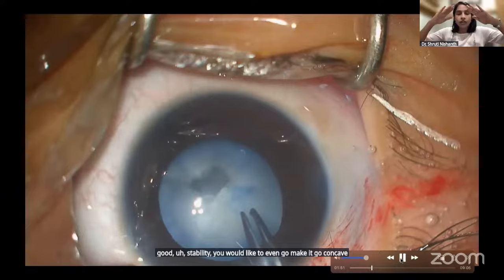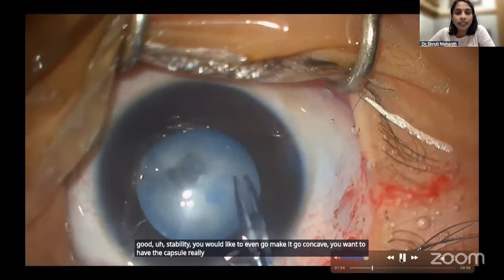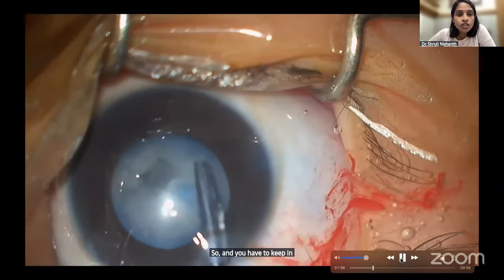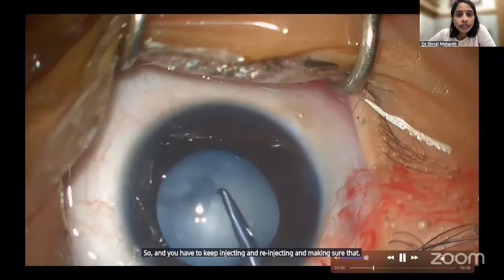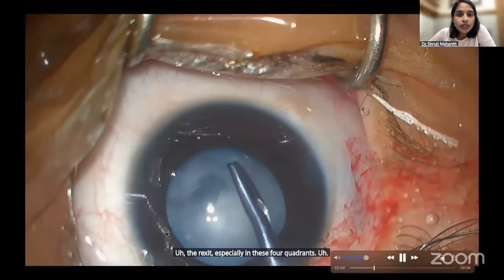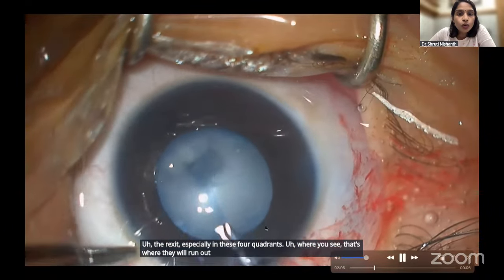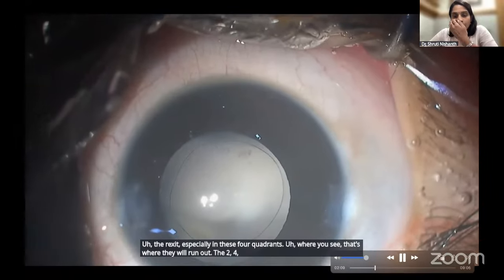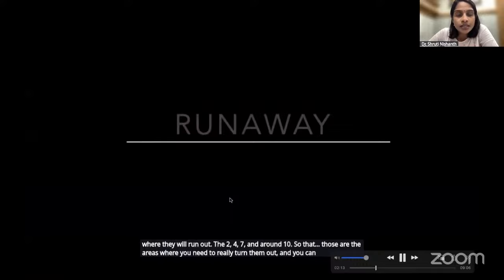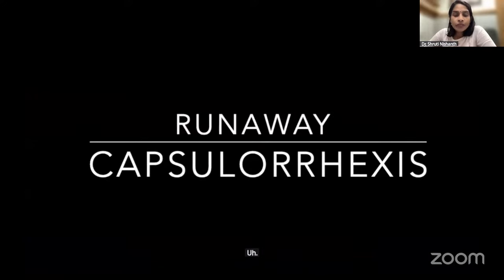You want to have the capsule really flat and not bent downward. You have to keep injecting and re-injecting and making sure that the rhexis, especially in these 4 quadrants where you see that's where they will run out, the 2, 4, 7, and around 10. Those are the areas where you need to really turn them out, and you can get a decent rhexis even in that. What do you do when you have a runaway capsular rhexis?